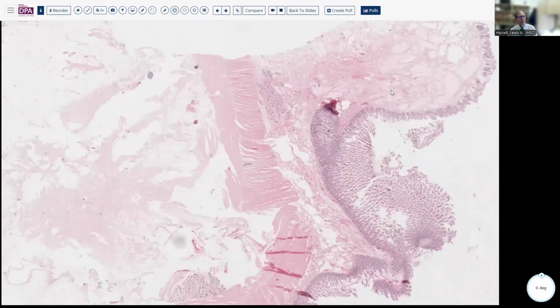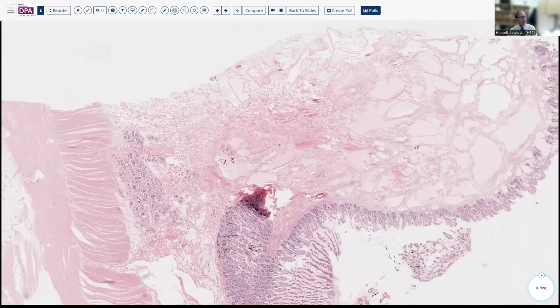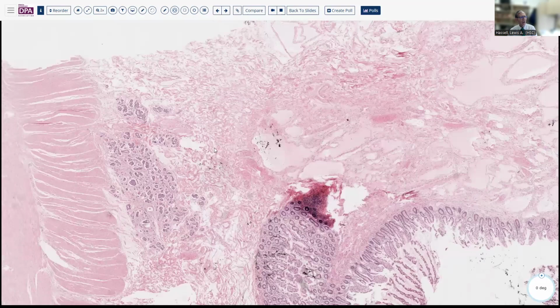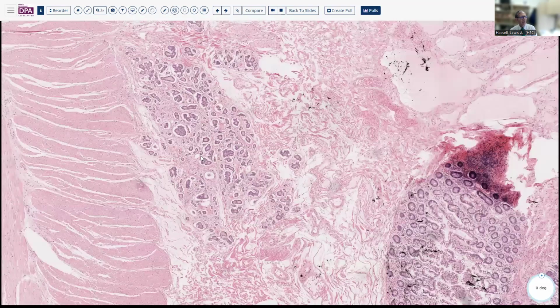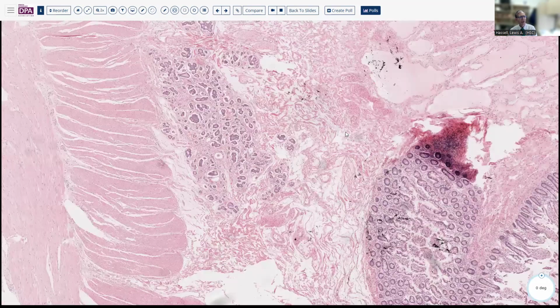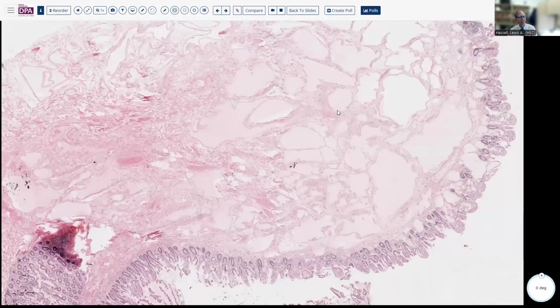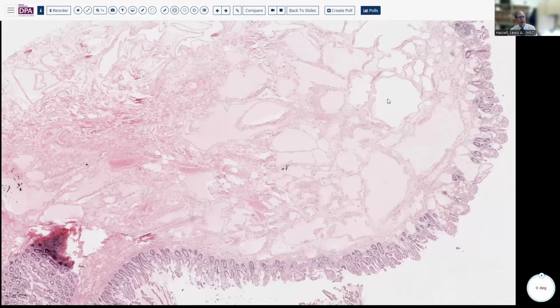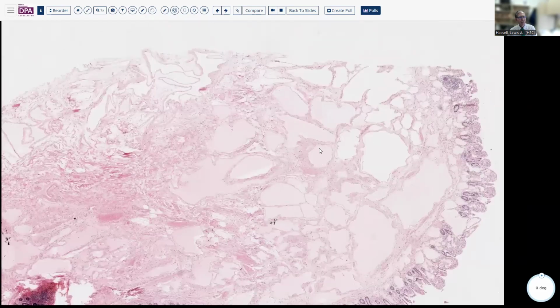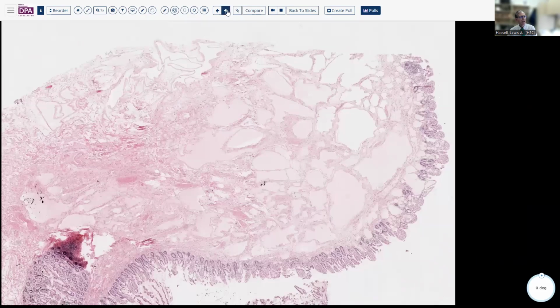And this is a case where the lesion was discovered incidentally as it was associated with the presence of a well-differentiated neuroendocrine tumor. Here, just a very small feature of a portion of that, but you can see again these very characteristic thin-walled, variably dilated channels with variable thickness to the walls involving the mucosa and submucosa.